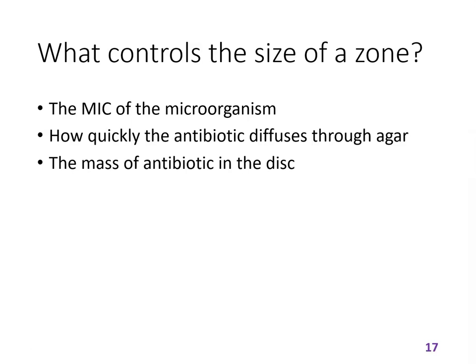That's enough for zones of inhibition and minimum inhibitory concentration, and I hope after looking through this and working through this, you will have a sense of what might be going on in the clinical labs in the basement of a hospital.